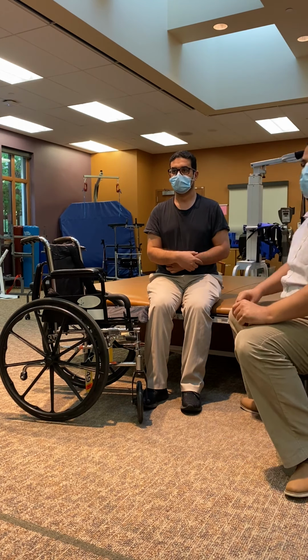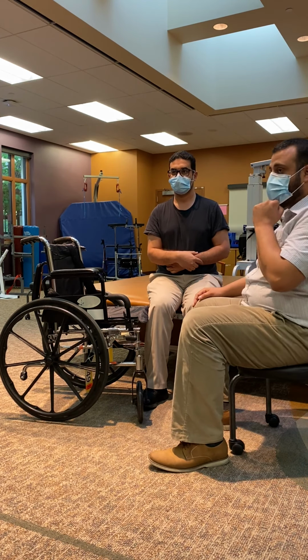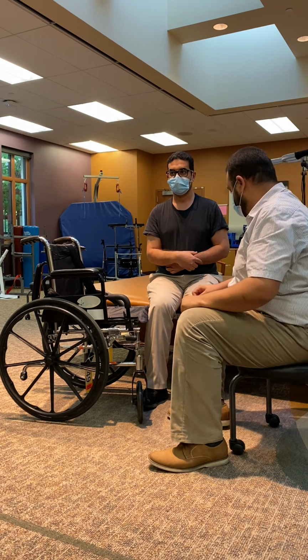If this patient needs minimal assist, I can do it in sitting with the patient. So, need to sit correctly here. Good job. We're going to do the same thing. I'm going to advance your right side forward. So lean please forward, left side, and bring your right side forward. Great job. Fix your feet here. And one more job. So feet are fixed, as you can see here.